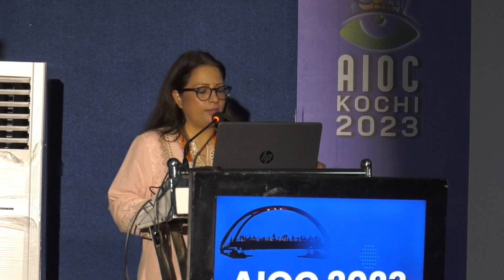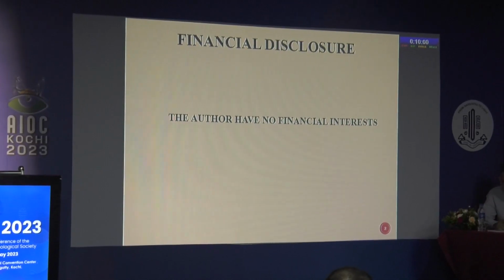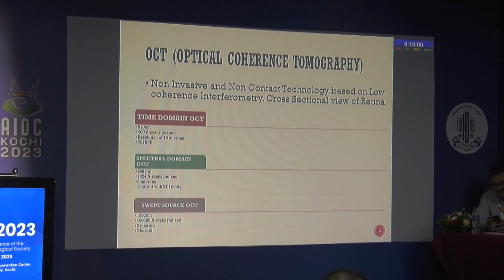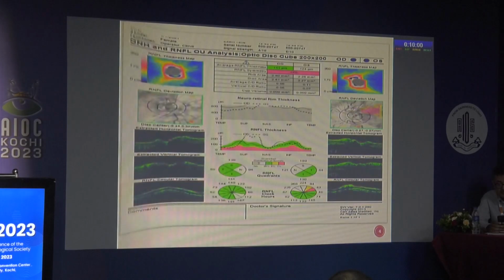Yes. Very good morning to everyone. Firstly, I would like to thank AIOS for giving us this opportunity. After such elaborate talks on retinal disorders, I would be moving towards the application of OCT in neuro-ophthalmological conditions. I have no financial interest to disclose. Now I will not discuss OCT as a machine because we have already discussed it very nicely. This is the evolution of OCT, which is a non-invasive and non-contact technology.